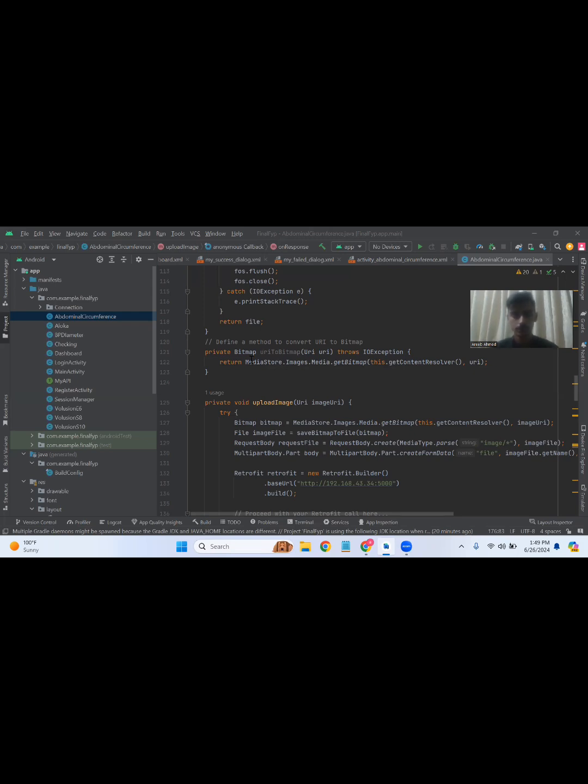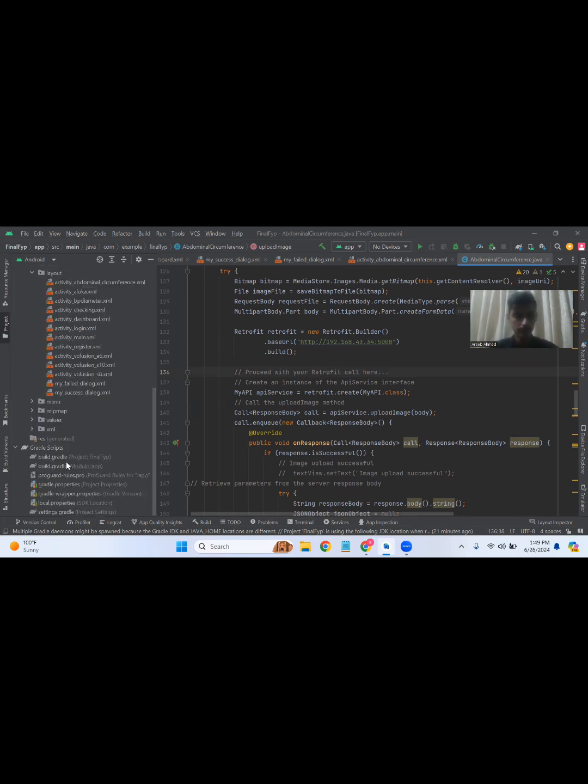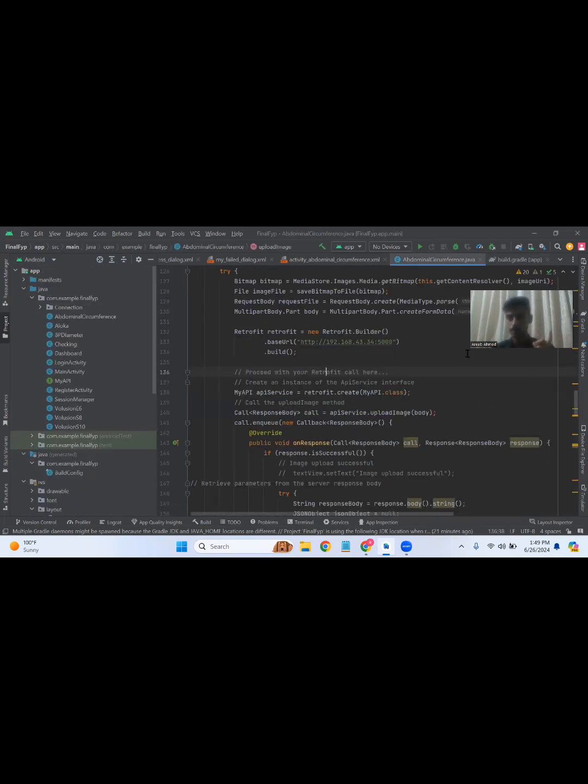So we made this upload image method, from where we can send our image to the main API of our Python, and from here we get our results. We use Retrofit as our main library for client-server connection, and we import all these in our dependencies. As you can see, here is our main Retrofit library, and we use Picasso for our main image work. When we upload this image to the server, it will produce our result. I'll show you all these activities in another video, where we can run our Android application and see all the results and all the work that we are doing here.